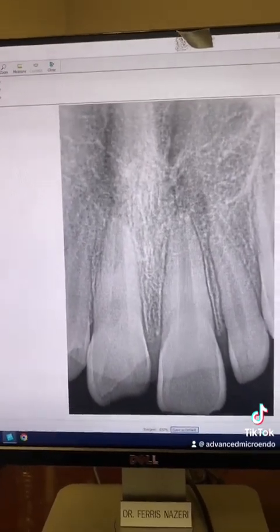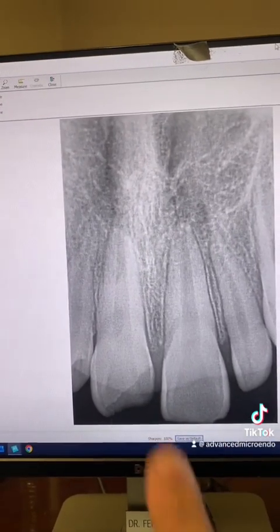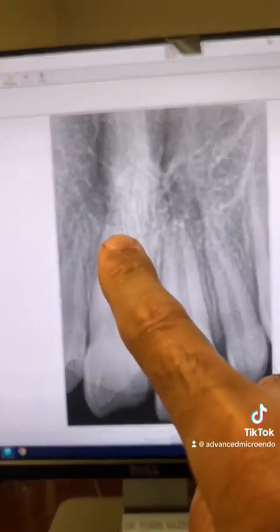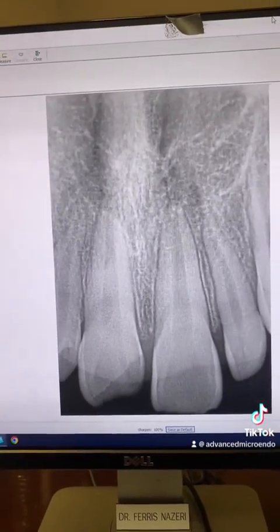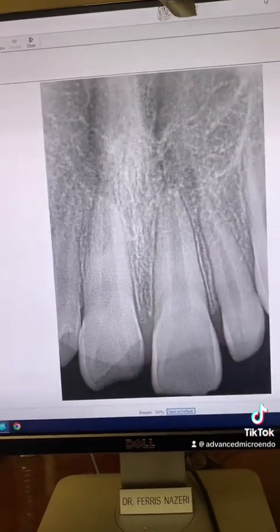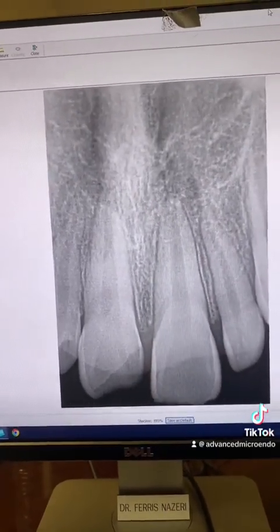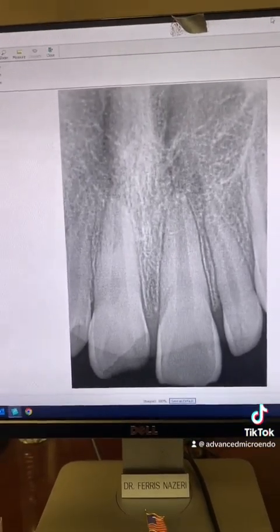She had all the signs and symptoms of irreversible pulpitis. So today I went ahead and sedated her and did the root canal. Look at the apical diameter. The apical diameter was 70 plus. So we were ready for an MTA plug. So let's go ahead and take a look, and I'll show you how I did this root canal and MTA plug, all in one appointment.